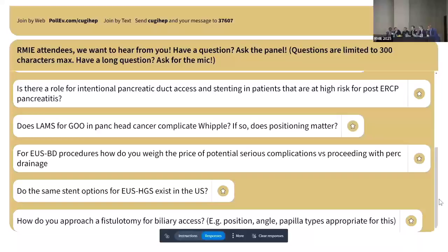So actually, we don't have very good criteria for endoscopists in Japan, even so. Each institution decides their own according to their opinion and their expertise. Because I think this procedure is still immature. There is no good equipment, even in the echo endoscope. The ERCP scope is very dedicated to perform the cannulation.